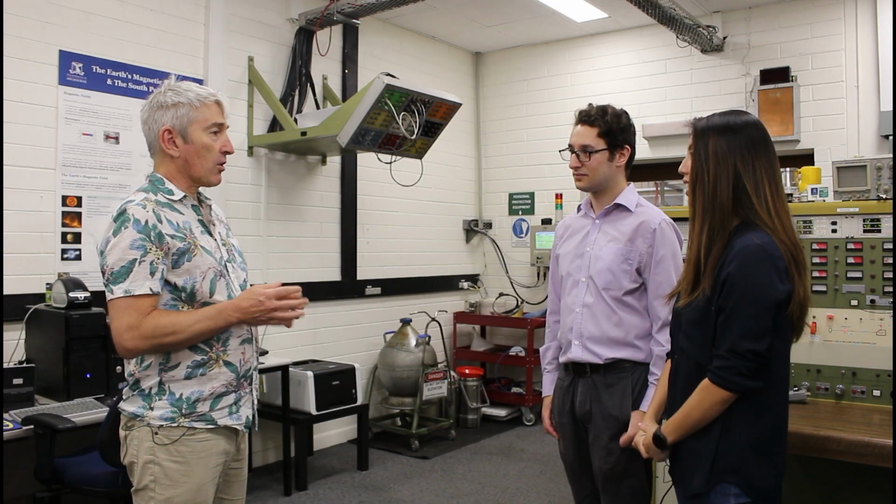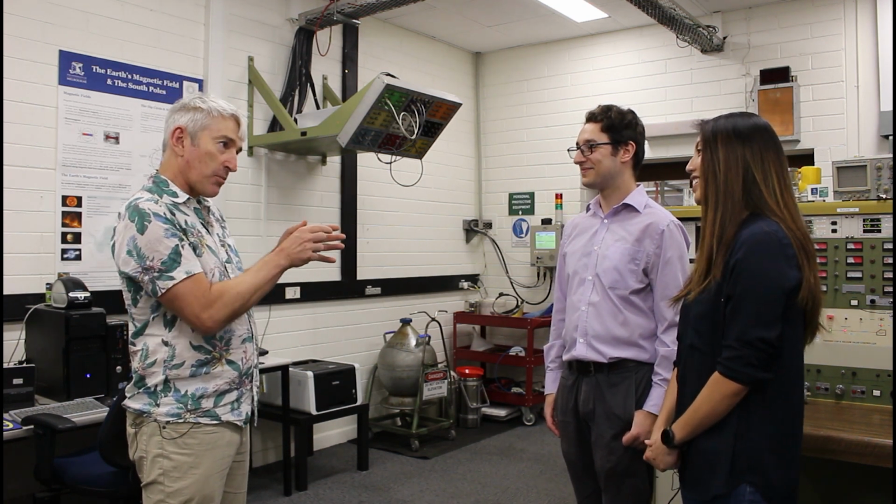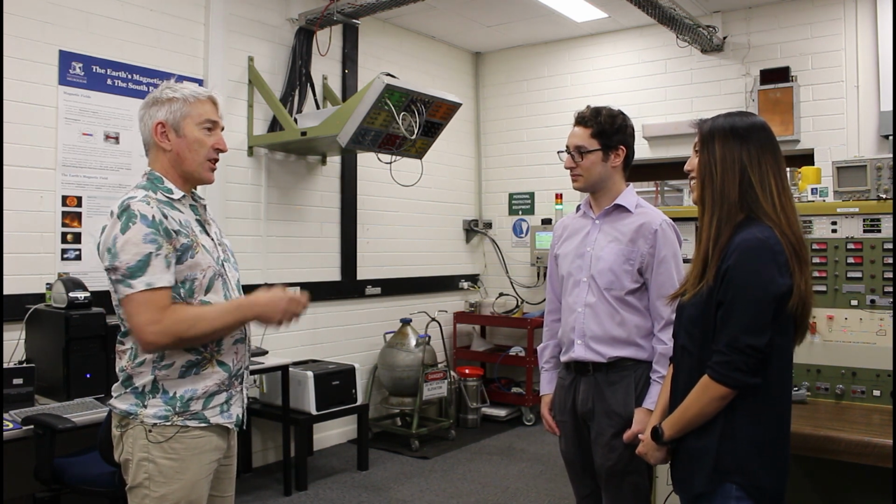Now, the Bragg peak is dependent on the initial energy of the protons. Yeah. Depending on where the tumour site is in the body, you can change that initial beam energy to position the Bragg peak. Sounds to me like putting in golf, that if you putt too hard, it'll overshoot the hole. You've got to get it just right so it just stops and drops all its energy into the tumour.